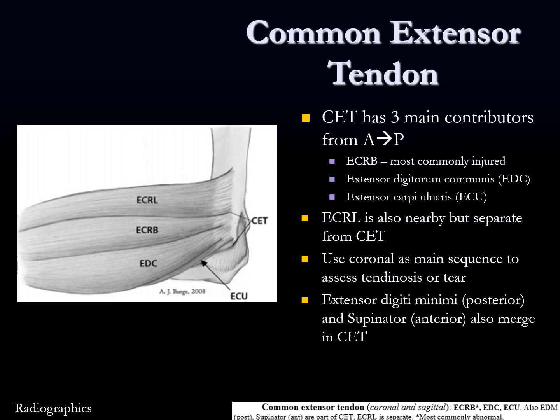The common extensor tendon is on the other side at the lateral epicondyle. It has three main contributors from anterior to posterior: ECRB, EDC, and ECU. The first or most commonly injured part is the extensor carpi radialis brevis (ECRB). The extensor carpi radialis longus (ECRL) is nearby but has a more proximal insertion on the distal humerus and is not a distinct part of the common extensor tendon origin. The coronal is the main workhorse sequence to evaluate this.